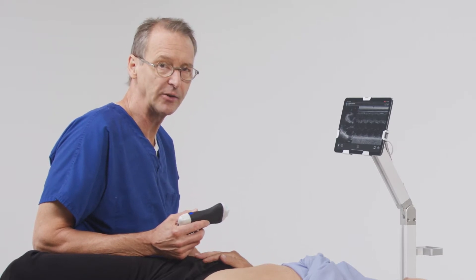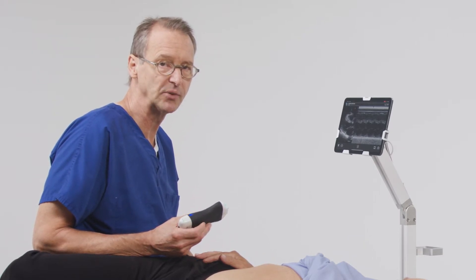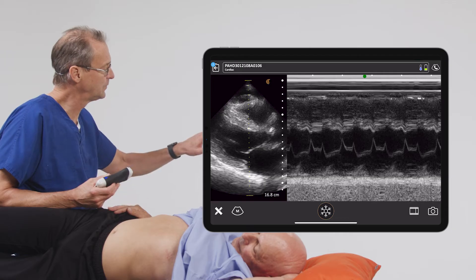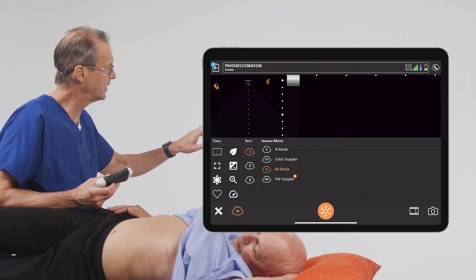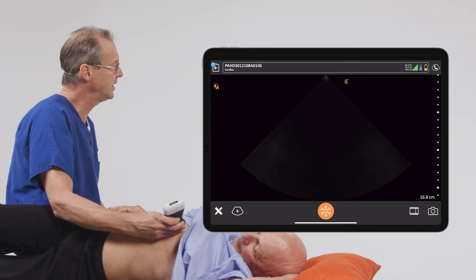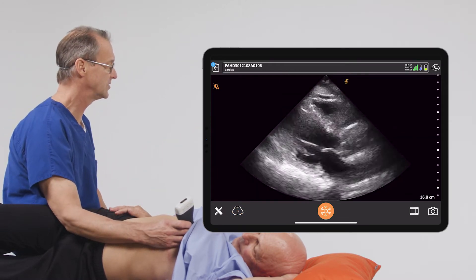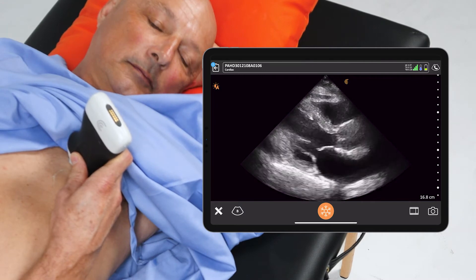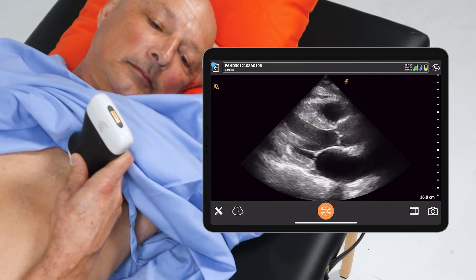EPSS, of course, is an acronym which stands for E-Point Septal Separation. To do this exam, we'll start out in B mode and get a view in the parasternal long axis. You can do this with the parasternal short axis, but we'll use the long axis for this particular demonstration.